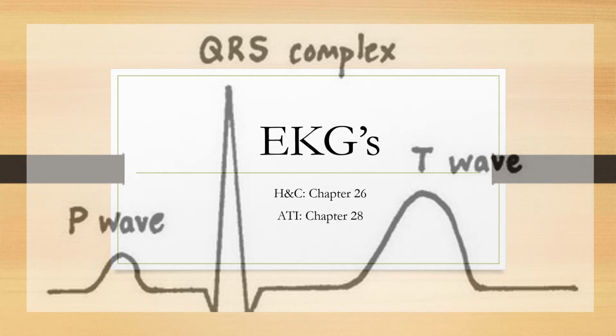Okay, so welcome to the electrocardiogram module. Electrocardiogram, or ECG or EKG, just depends. It's spelled both ways, with a K or with a C. It means the same thing. We're going to be talking about the electricity of the heart, and the electrical waves that it produces on the leads that we attach to a patient.